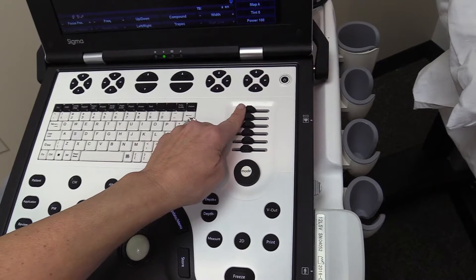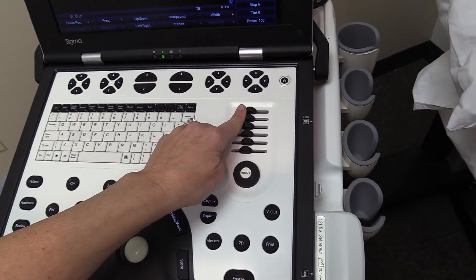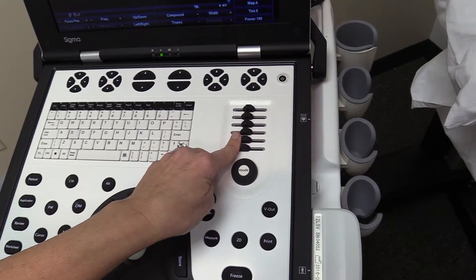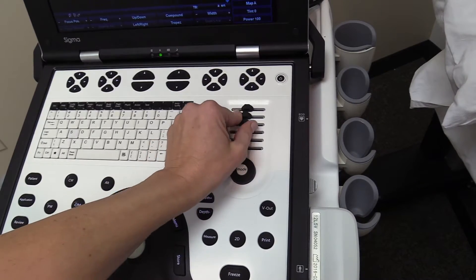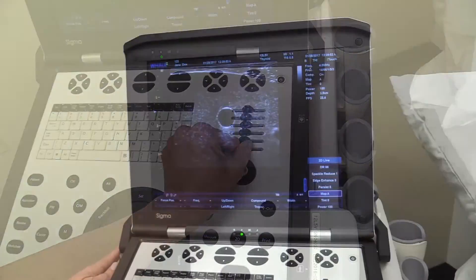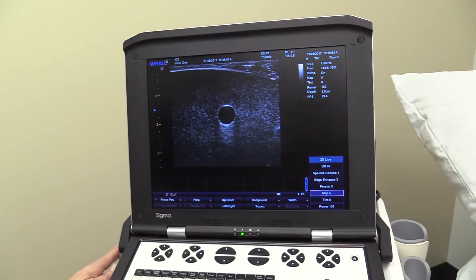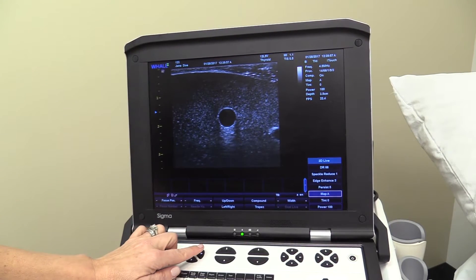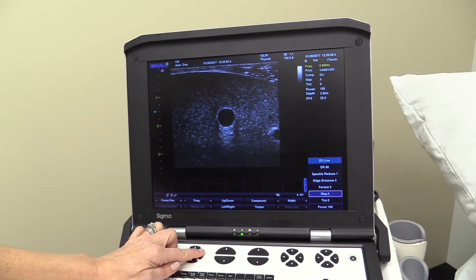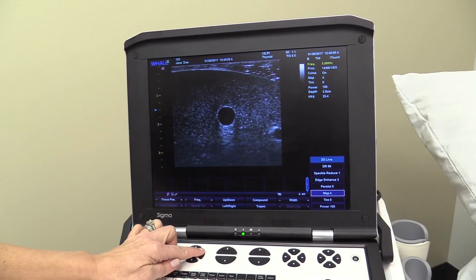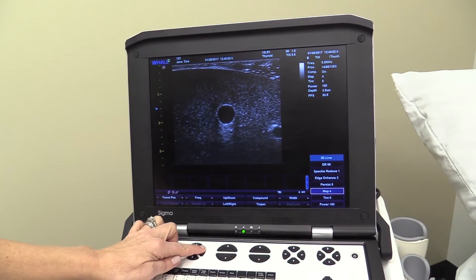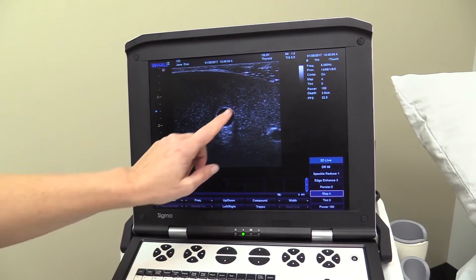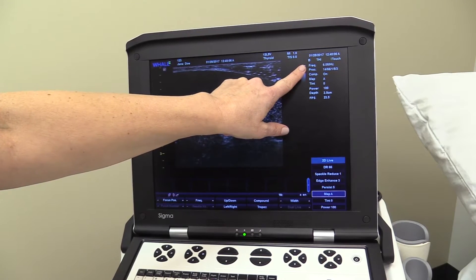By adjusting the TGC sliders, the gain may be optimized at different levels throughout the field of view. The frequency is displayed on the status window and can be adjusted during the exam. The change in frequency is displayed on the top right corner of the screen.